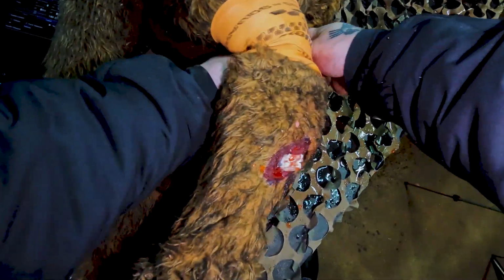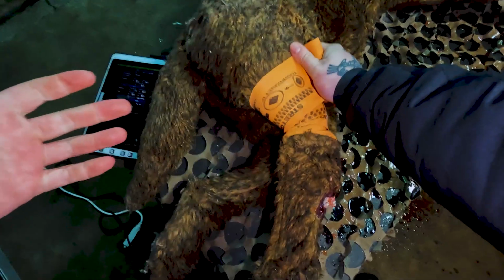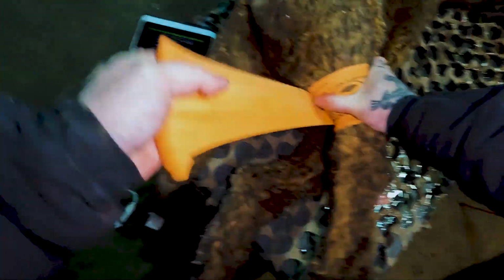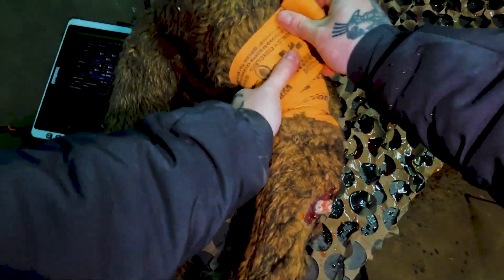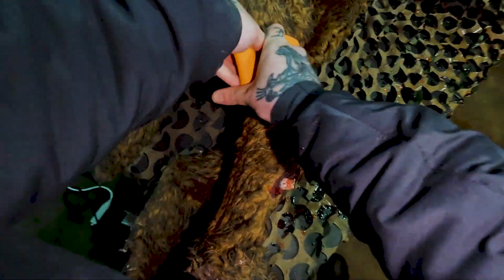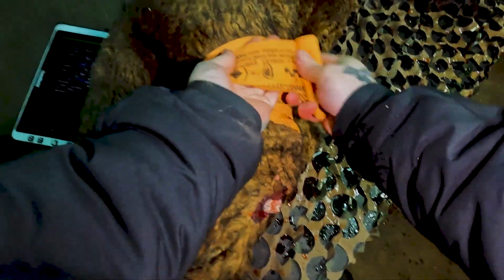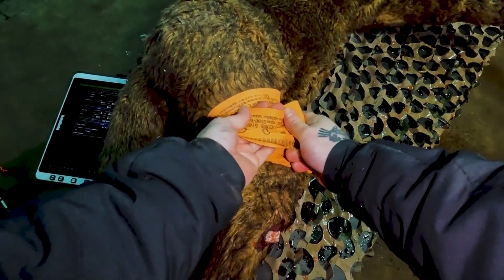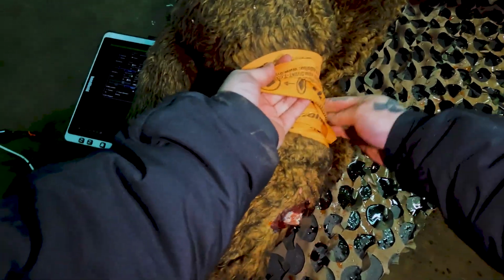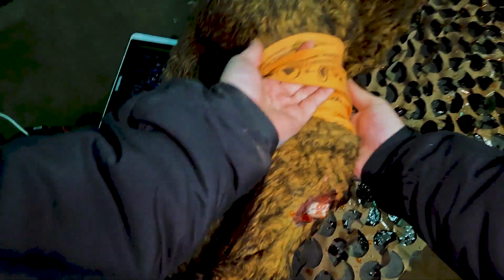The more you wrap this, or an ACE wrap, the more secure it's going to be, and the less it may shift while you're moving them. Same thing when you want to get into the end of the roll. You place your hand underneath it, underneath that loop.